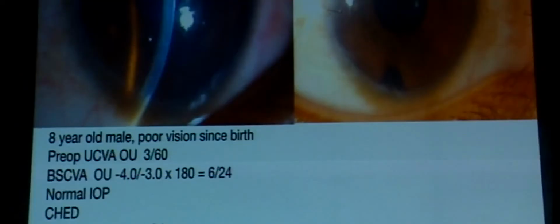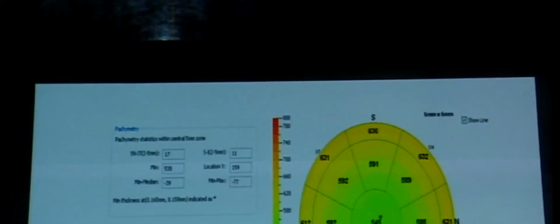That's how the patient looked at 1 month post-op, and you can see that the cornea looks much clearer than it looked pre-operatively. His visual acuity post-op with best spectacle corrected of -4 with -5 cylinder, possibly because of the suture that we placed temporarily, improved to 6/12. His specular count was 2,247 cells per millimeter square, and the pachymetry, which was 864 microns pre-operatively, had reduced to 539 microns post-operatively. So there was a good resolution of the corneal edema.